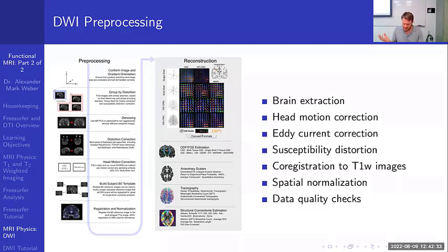So diffusion weighted imaging is generally collected over the entire brain with repeated acquisitions while varying the orientation or the magnitude of the diffusion gradients. DWI, like fMRI, has low signal to noise ratio, and the resolution is also pretty low, oftentimes pretty similar to fMRI, and very susceptible to motion. So to reduce the influence of motion artifacts, the scan time has to be reduced. And so once again, we meet our friend echoplanar imaging to try to speed things up. But this then introduces things like susceptibility-induced artifacts that we're going to have to correct for.